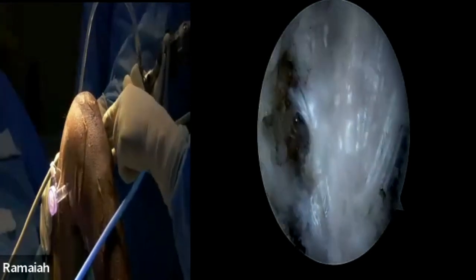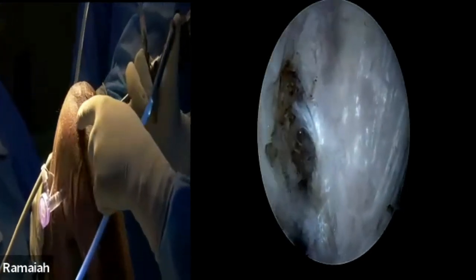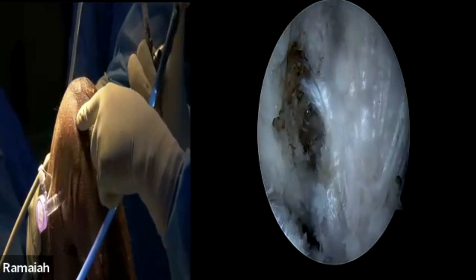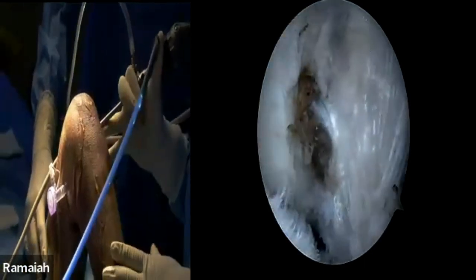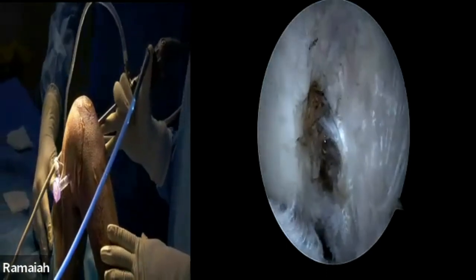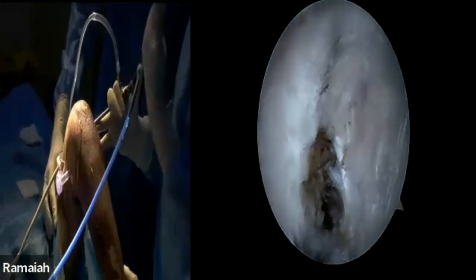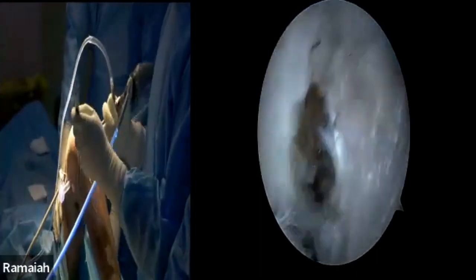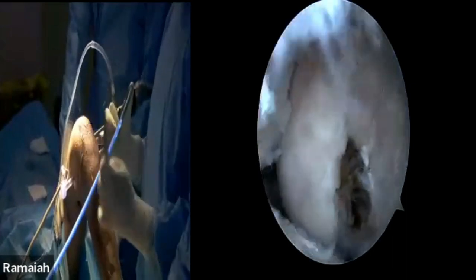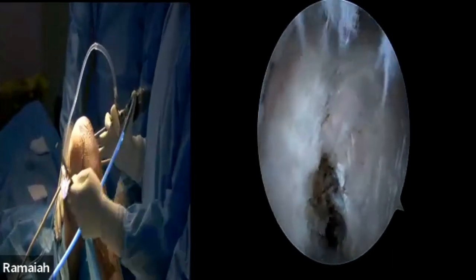What you see here is the patellar marking. This is a standard anterolateral portal, slightly higher than standard, and this is a standard anteromedial portal — this is for the working portal and this for the visual portal. This is the left knee we are operating. I'm assisted with Dr. Prathima, Dr. Alfie, and Dr. Santan — both are PGs — and Prathima is an orthopedic consultant.